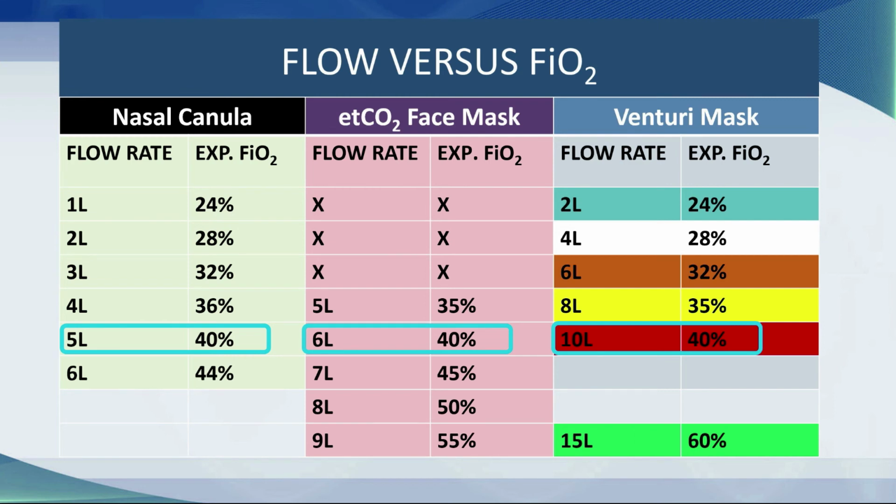The difference as you go up with this, from nasal cannulae to standard face masks to Venturi masks, there's a pretty amazing increase in the amount of flow that you need to give. And the reason why the Venturi requires a higher flow is twofold.